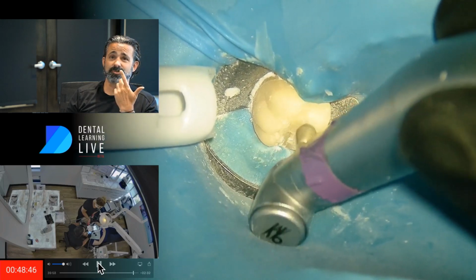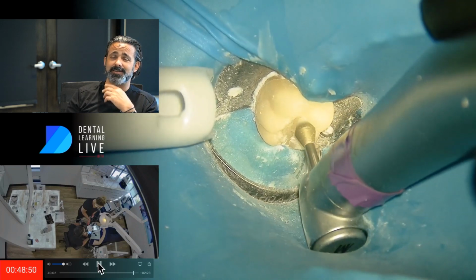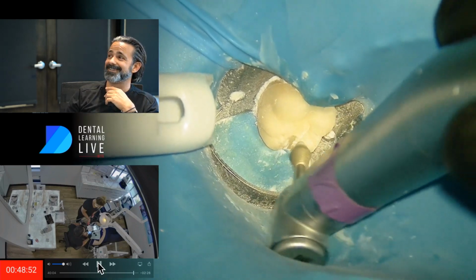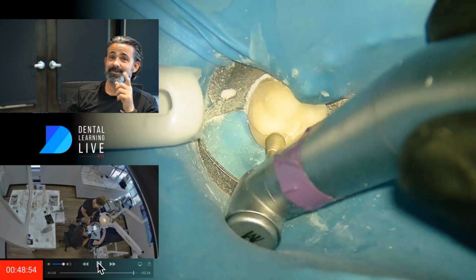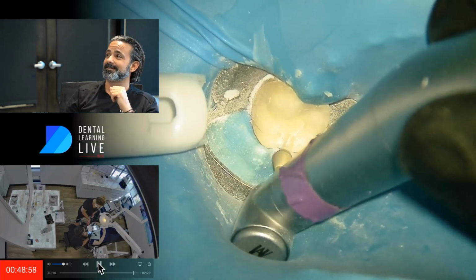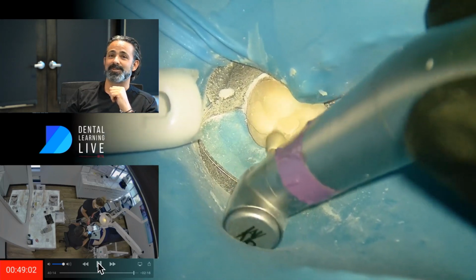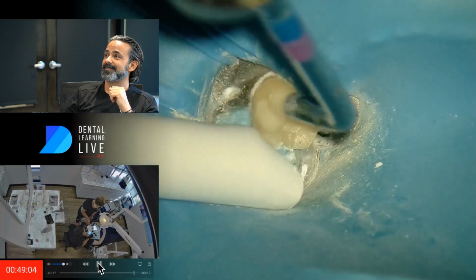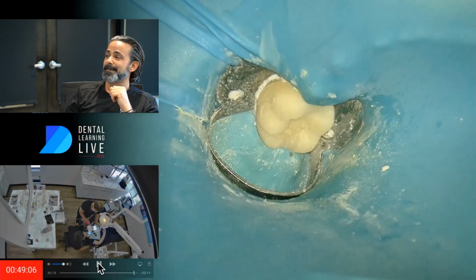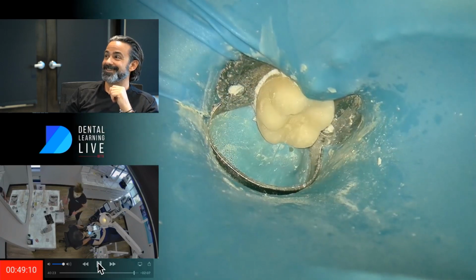You can write your initials in the composite. Patients don't care if you do that. You just sign it. Just kidding. You can say this was done by me. Put a big old F for Facer in it. Kind of sounds funny, but I have had that request before. But use a flame if you do that to describe it.